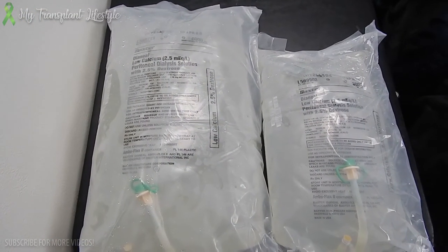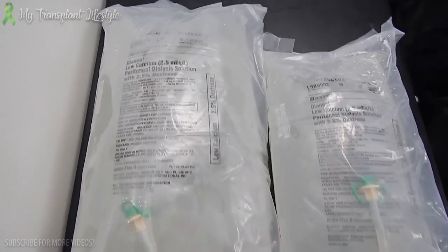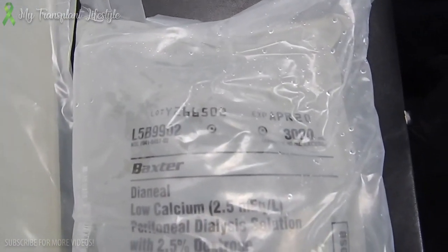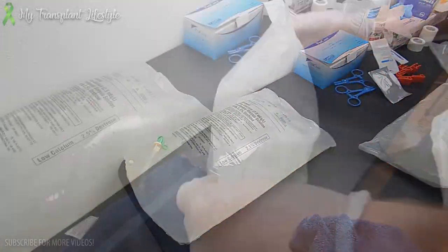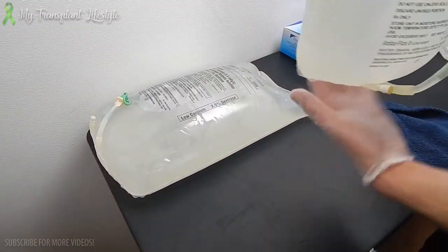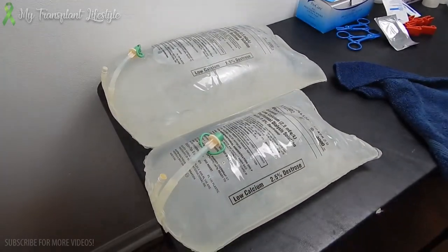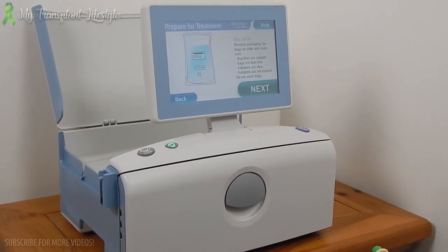Based off my treatment, these are the 2 solution bags I will be using tonight. 2 greens, 1 that is 6,000, and the other that is 3,000. Both are 2.5s. When opening the bags, you want to make sure there is no leakage, it is not expired, and wipe down any excess liquid on the bag. Once you gather all your solutions and your cassette, press next.